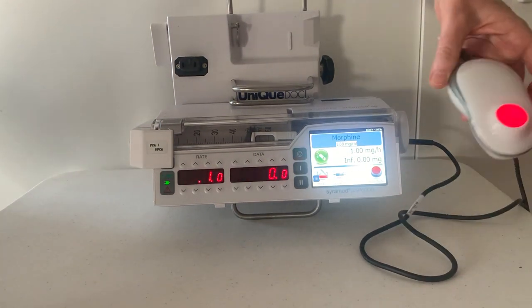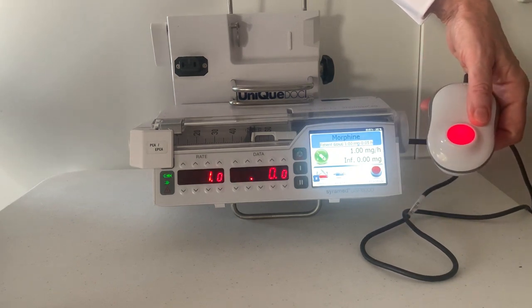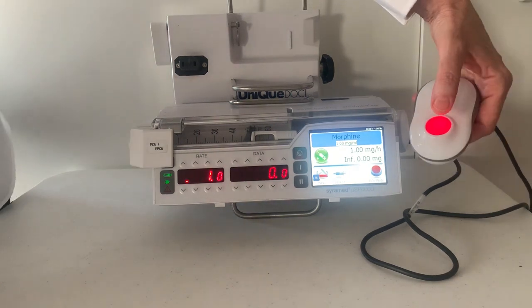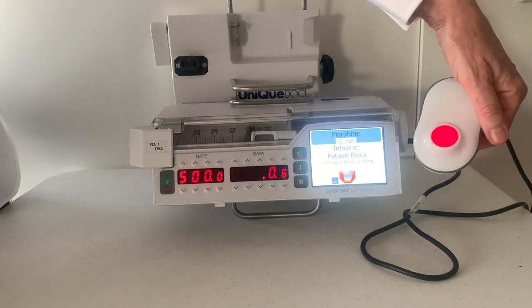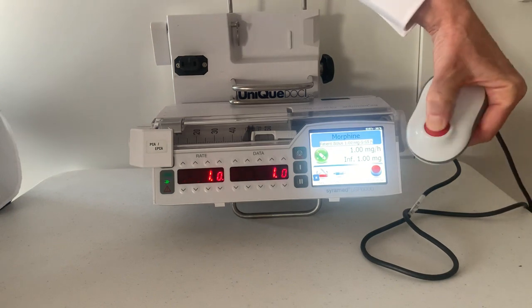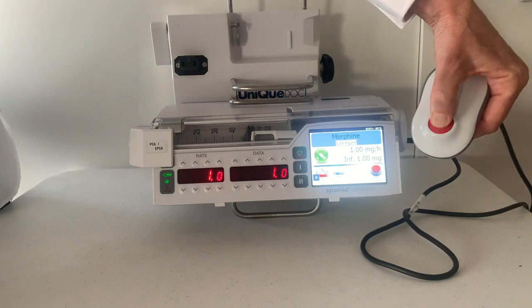To give a patient bolus, the patient bolus button is ergonomically designed. The red light indicates it is properly connected and working. Press — one beep indicates that it's a successful bolus. Press again — two beeps indicates it's been refused.